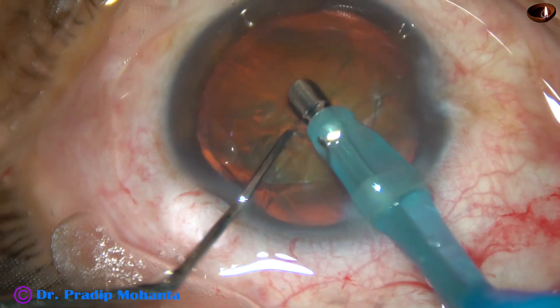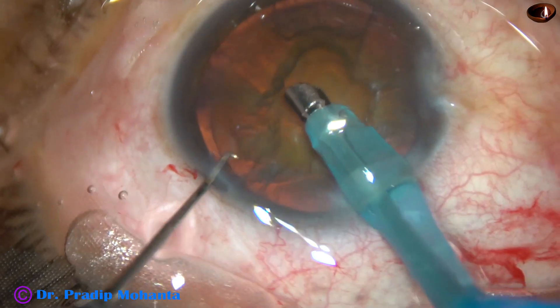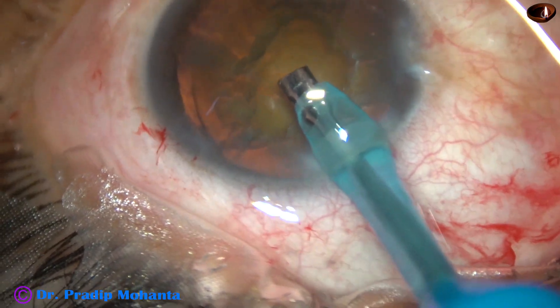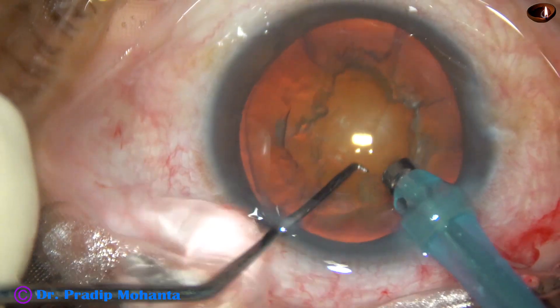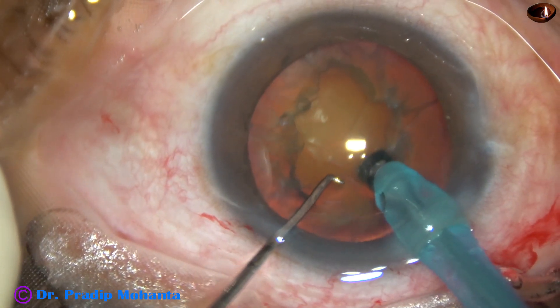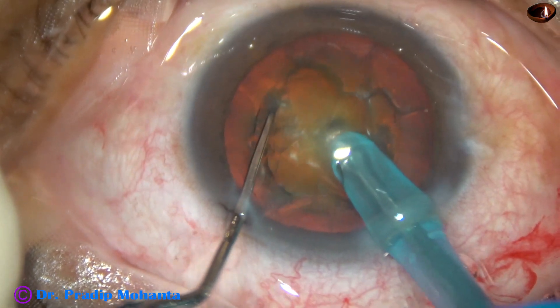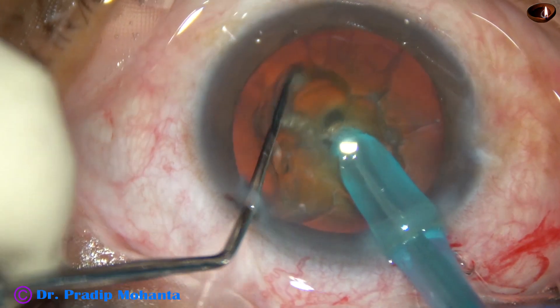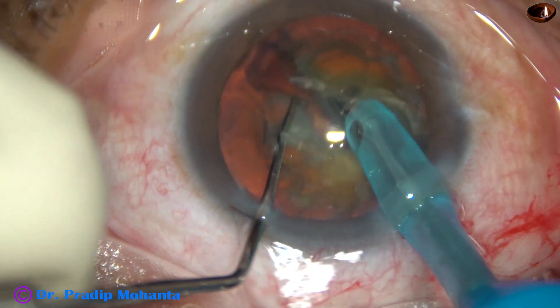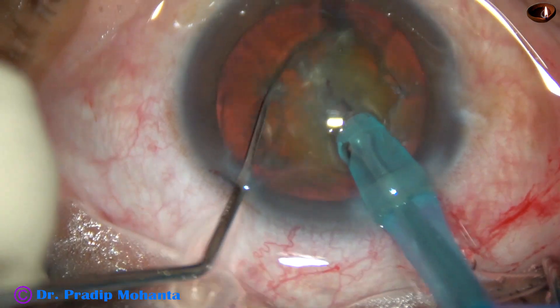Some superficial cortical matter is removed. See the submarine chop — the phaco needle is rotated, bevel is up towards the cornea now. It is buried into the substance of the nucleus and goes through the nucleus towards the opposite equator, just like a submarine moves through water. Then it is chopped, and this is a nice crack.